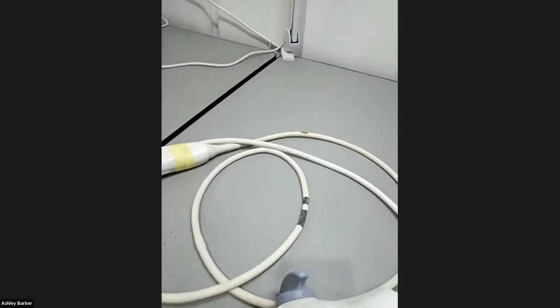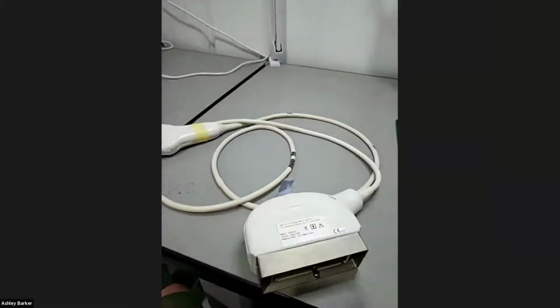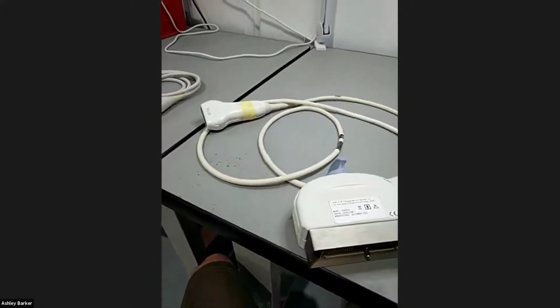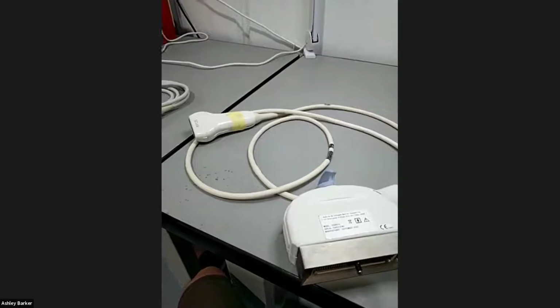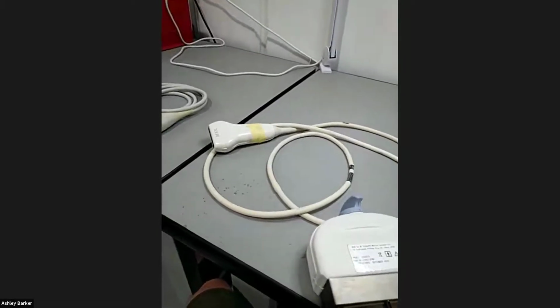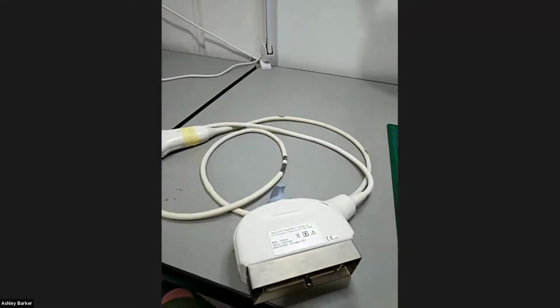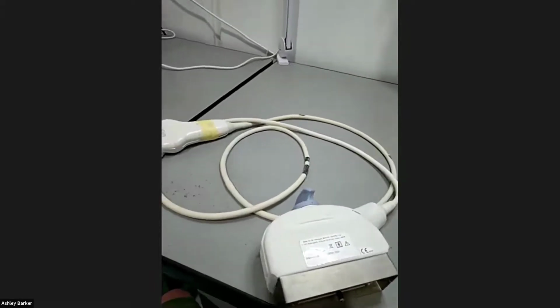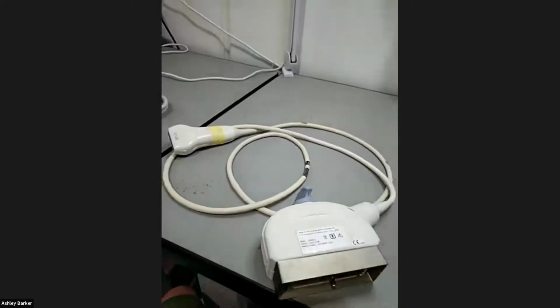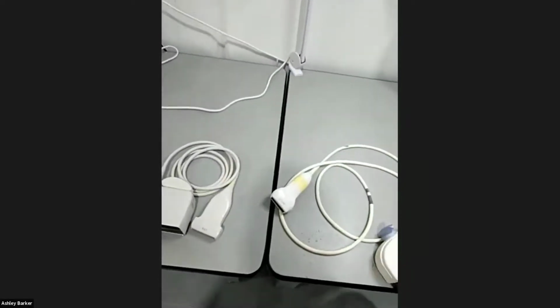Yeah, that's a nice solution, and you've got wireless probes coming out now as well. That's probably a good point to mention, wireless probes, because everyone goes, oh, that's great, they won't get damaged, but they come with their own set of problems, because if you do drop it, there's no cable to grab before it hits the ground. And the other thing is, of course, people put it in their pocket and walk off. Yeah, exactly. Or the linen basket. There's all sorts of things that can happen with those. There are different problems with different ways of doing it, I guess.